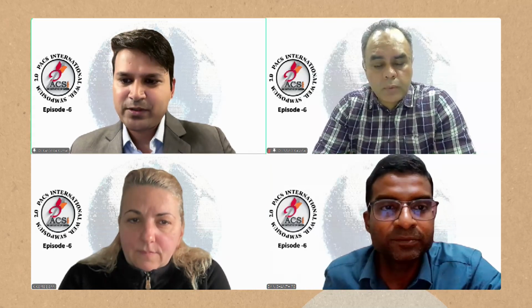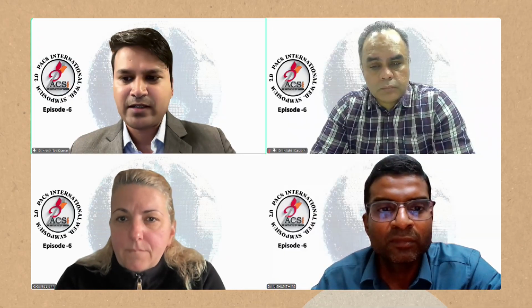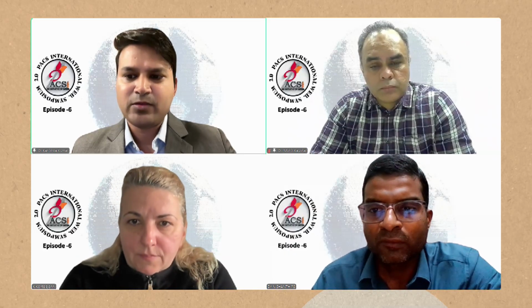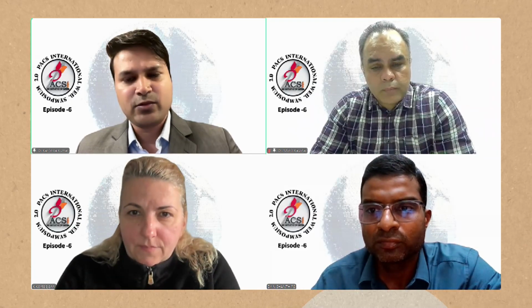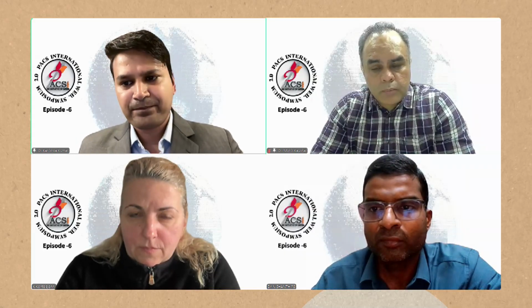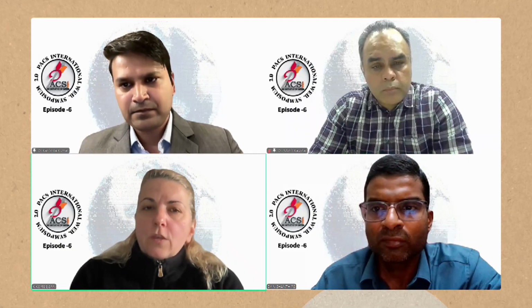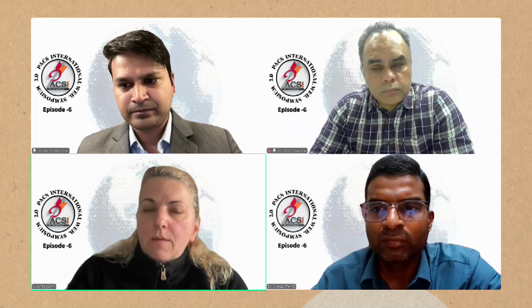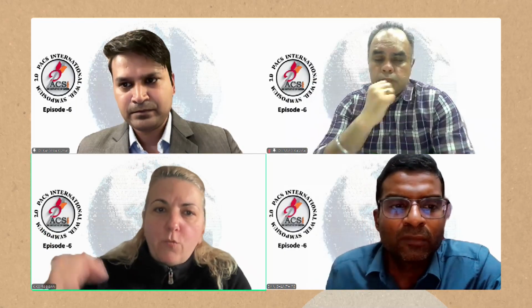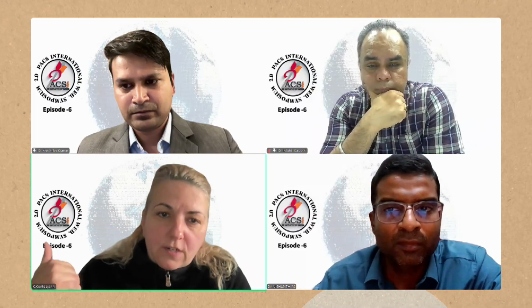So, ma'am, the question to you: you mentioned the role of oxymetazoline, topical tranexamic acid and adrenaline. Dr. Satvik Manchanda from Delhi wants to know about the dose, or what dilution is good for xylometazoline, oxymetazoline or tranexamic acid. We use 2 milliliters, and flush it with a lot of air, because the 2 milliliters stay in the working channel of the bronchoscope. So we really have to flush the bronchoscope with a lot of air afterwards, in order for it to come down to the bleeding where we want it.